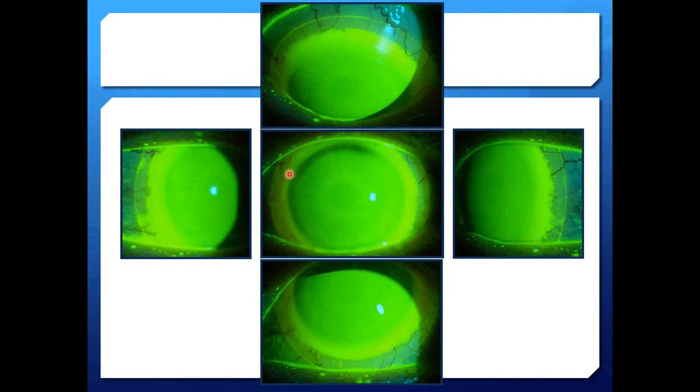The rule of thumb that we use at Pacific University is if there is less than 180 degrees of this thinning, we just let the patient go. We'll have the patient back in after a full day of wear, and we'll want to pull the lens off, stain the cornea, and make sure that we don't have any ruffling of epithelium here, that isn't in fact vault, that it's possibly touch. So if in doubt, if it's less than 180 degrees of thinning, probably not an issue. But do the fixation change test to see if with that slight change in fixation, the lens appears to vault.